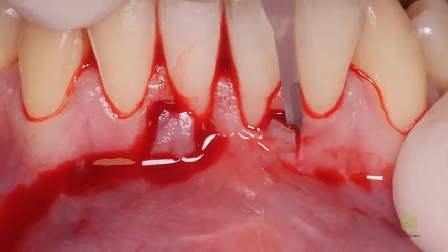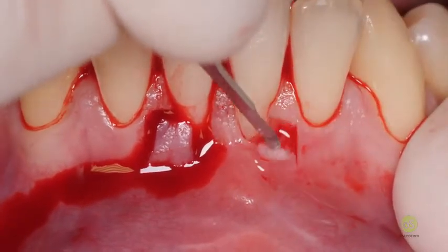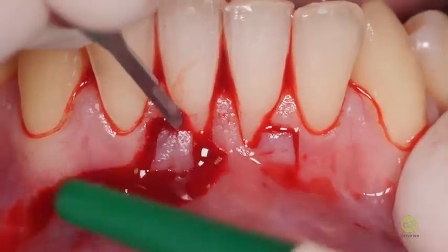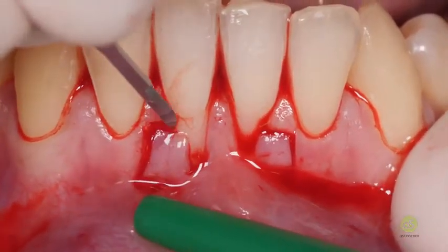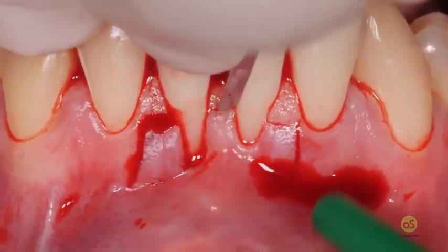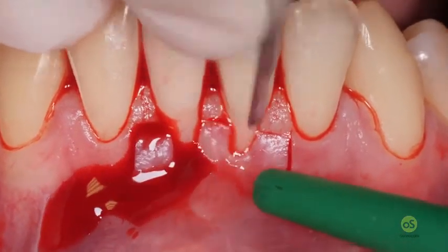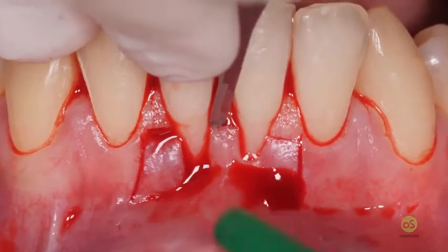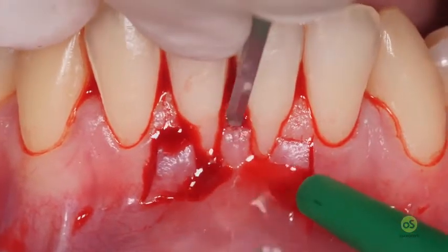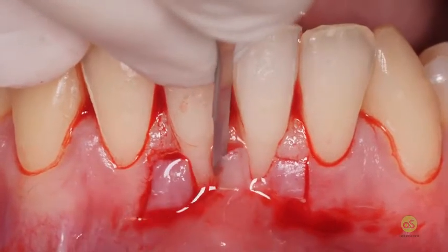This is the second one. Papilla. It's a bit easier because there is shallow recession with respect to this one. And now the most difficult of all, bevel, rotation, bevel, rotation.